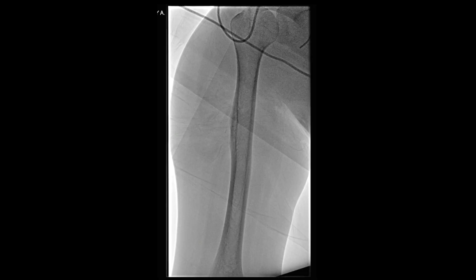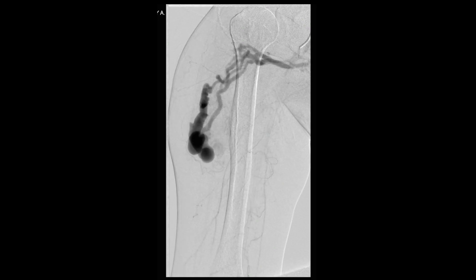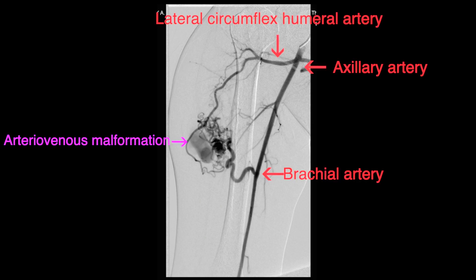We began by accessing the right common femoral artery under ultrasound guidance. This was followed by upsizing to a 5 French sheath over a wire. After selectively catheterizing the right axillary artery, a right upper extremity angiogram was then performed, as shown in this video, that demonstrated an arteriovenous malformation.